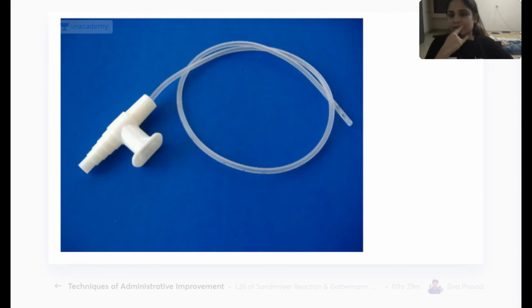All right. Identify this. Give me its use. It's not an IV set. It is a suction catheter. But what is it used for suctioning? It is a very specific suction catheter. You put your thumb over here, and when you press the thumb, whatever is around will get suctioned out from the suction catheter. So this is an intratracheal suction catheter.